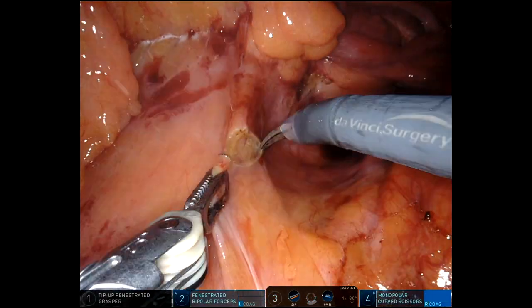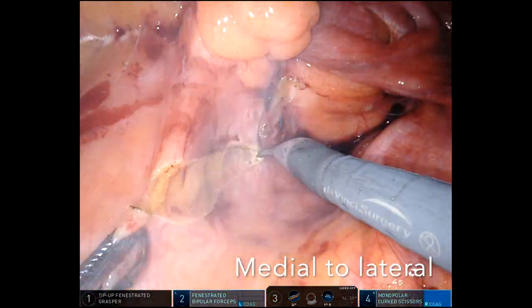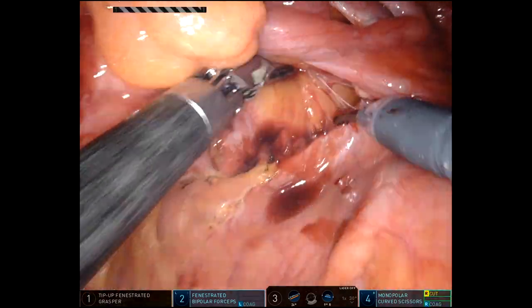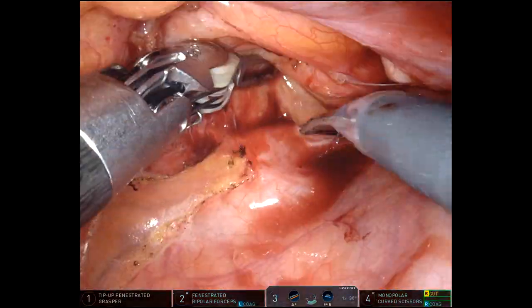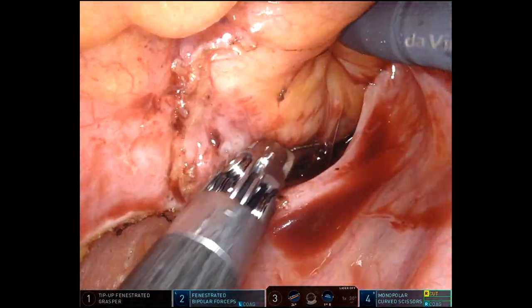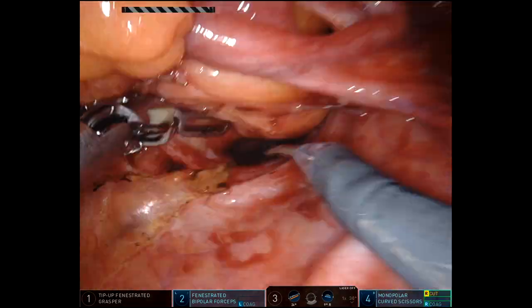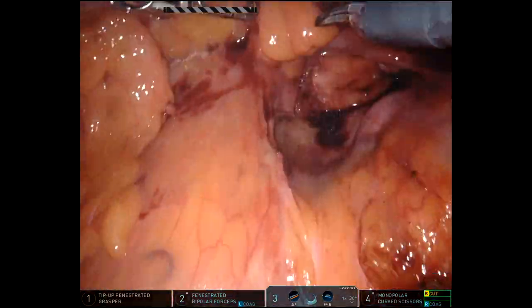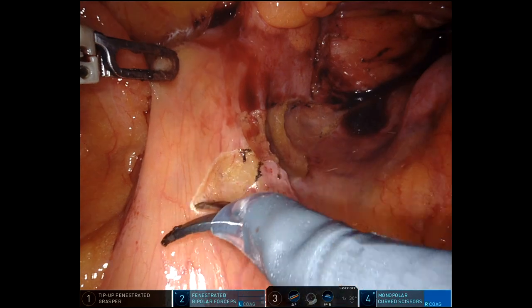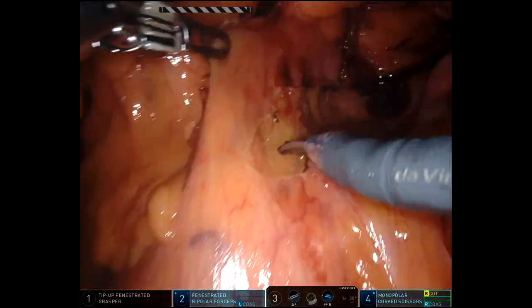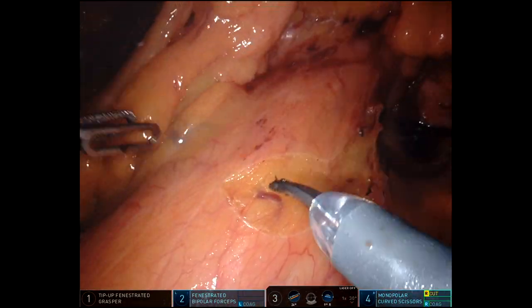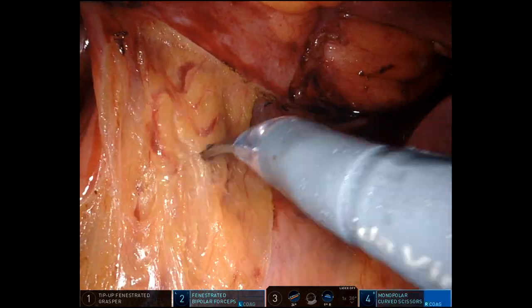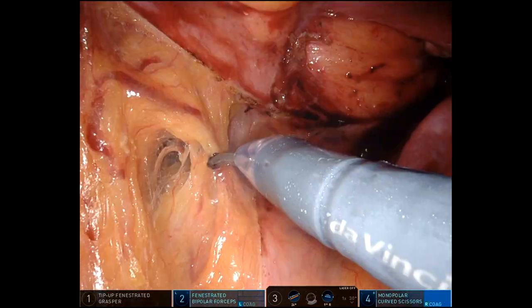Now we'll move on with the medial to lateral dissection. I actually like leaving the lateral fibrotic and inflammatory adhesions attached to the sidewall because it serves as natural retraction, and usually the retroperitoneal plane is unviolated by the inflammatory response, so I'll go ahead and do a medial to lateral approach.